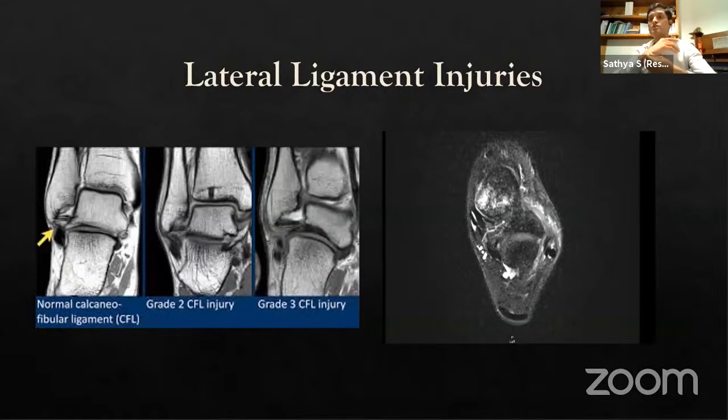So that tears them. That tear is differentiated again; initially we used to call it mild, moderate, severe, or grade 1, grade 2 or grade 3: minimal injury, partial injury, or a full injury, a full thickness injury. So there are so many different presentations there. Sometimes you try to compare to the normal side and do a justification by understanding what is happening. But an MRI scan will allow only one side because it is highly expensive. You can't put both ankles in for comparison.